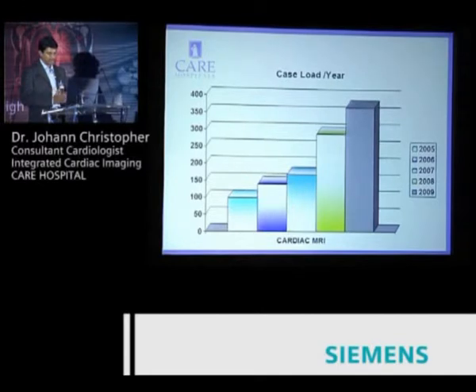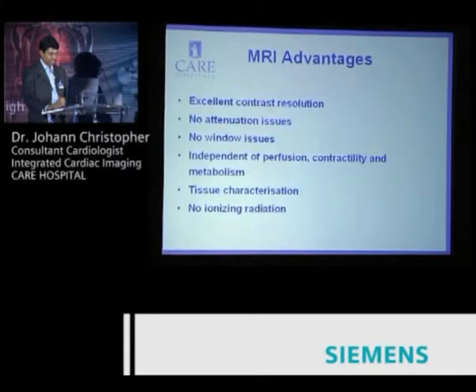So there's a lot of those children that we image, and because we have this dual source CT, we have been sort of moving these children from the cardiac MR to CT, and I will just show you some of the reasons. So a good amount of work is a little earlier work. Recently we have more of CT, but nonetheless I'll just try to cover the important aspects of congenital MR imaging, and this is a workflow which has sort of increased over the last 5 years. We've been in MR for the last 5 years.